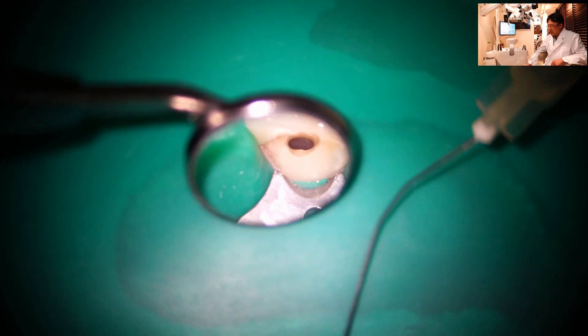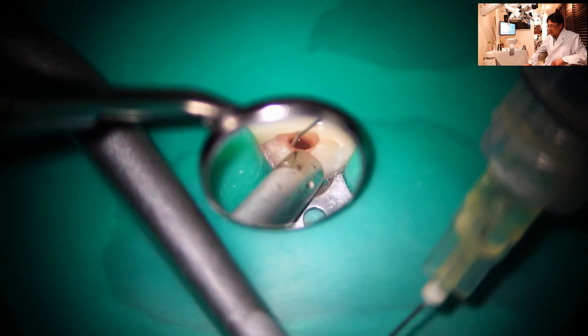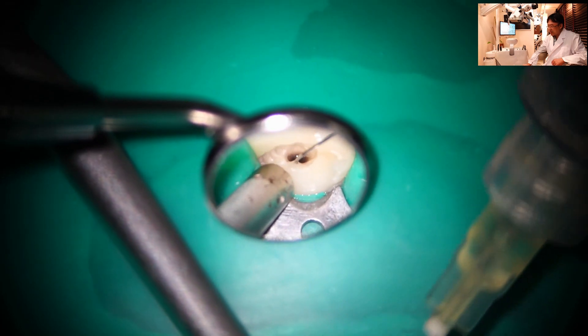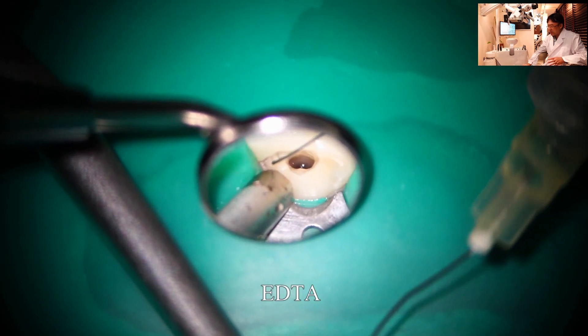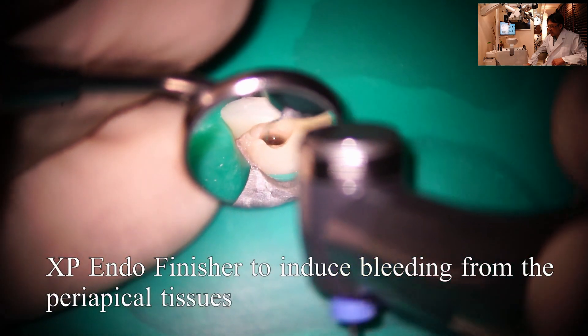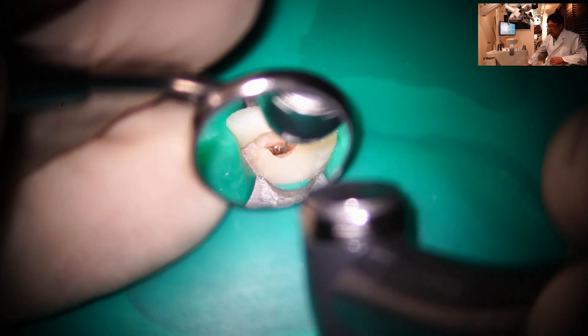So I'm irrigating the canal with sodium hypochlorite and EDTA. Then I want to induce bleeding with a next endodontic file.